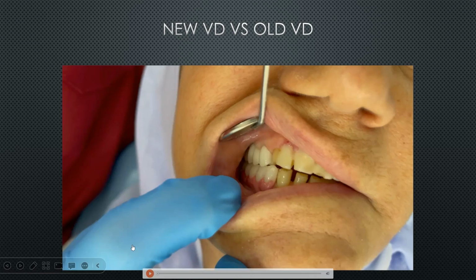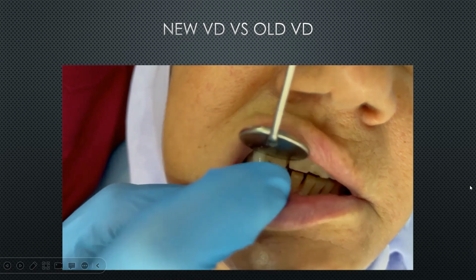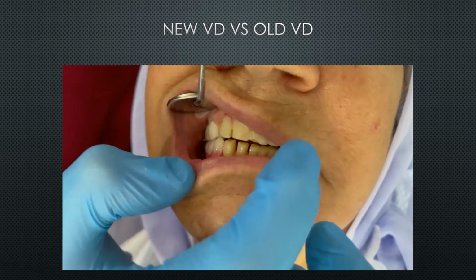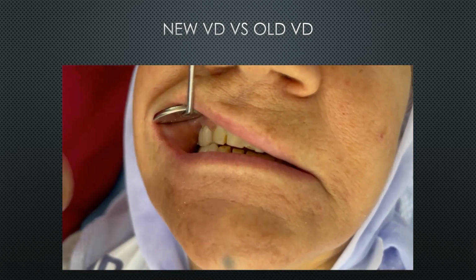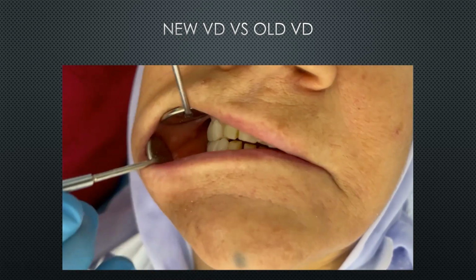So here, this is the temporary and the old vertical dimension. This is the bridges of the new vertical dimension, and we see the old versus the new vertical dimension. This is the increase in vertical dimension we see. So you have to make the teeth in contact according to the new vertical dimension.